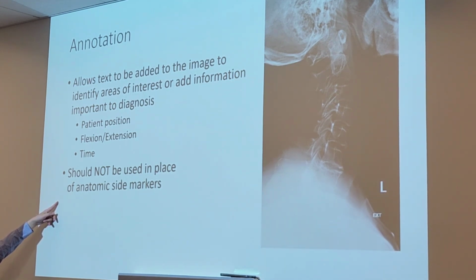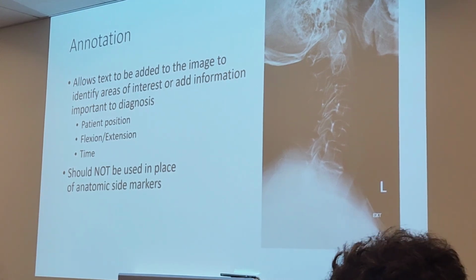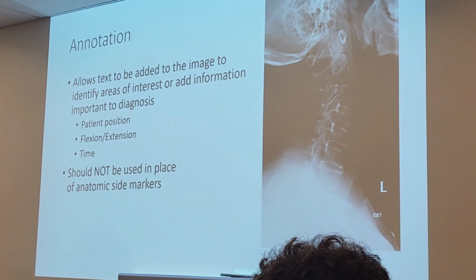Side markers. Digital annotation should not be used in place of anatomical side markers. Okay, what on earth is an anatomic side marker? Hold them up. Show me your anatomic side markers.